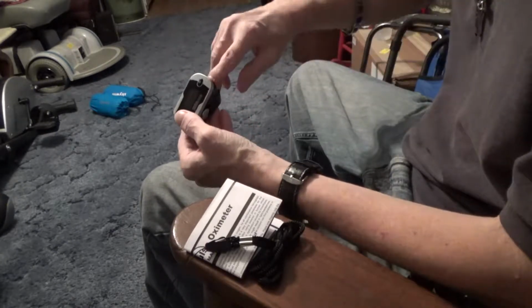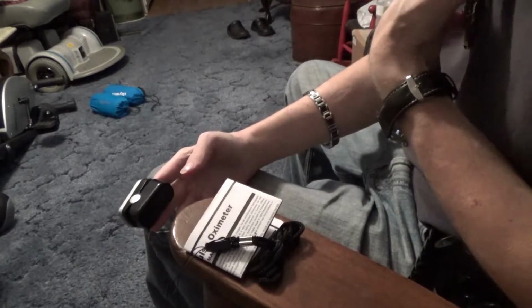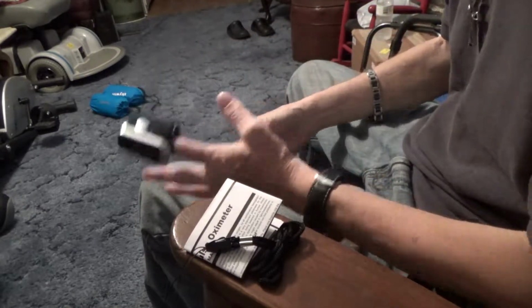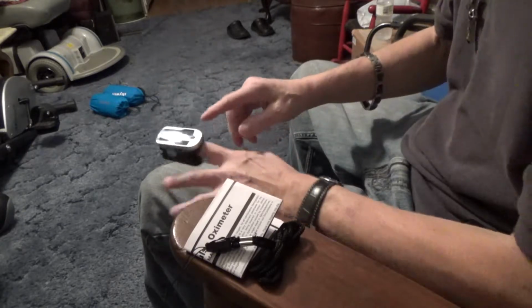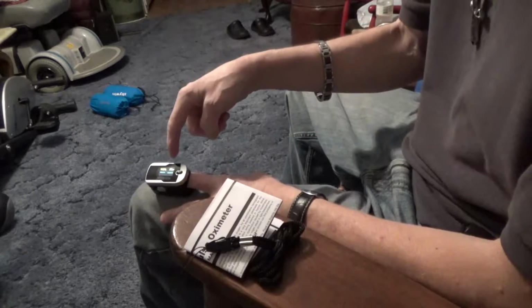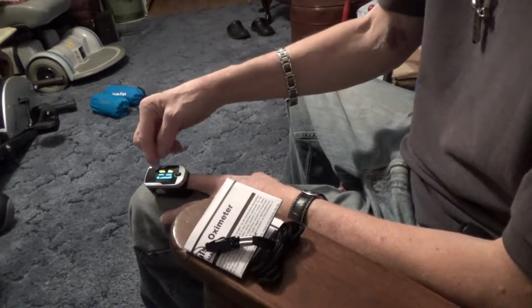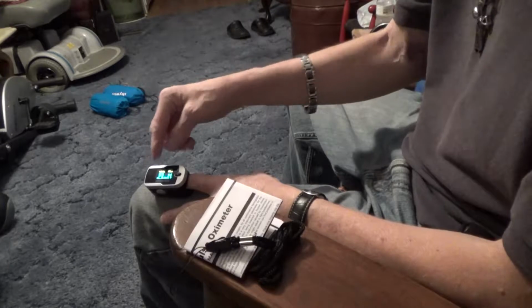Now, if I put this on this arm, I have hemodialysis and a lot of heart issues. This thing doesn't seem to like that very much, so it doesn't work very well. But if I put it on this finger, it seems to work just fine. So basically we just put it on. I'm going to lay my hand down because it's easier for me to keep it still. Push it on, it comes on and says version. We have the O2 stats, and we have the heart rate, and we have a little graph across the bottom. There's also a battery indicator when this begins to get low, which is really nice.